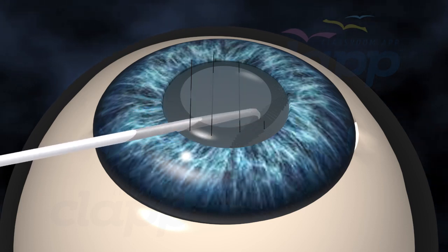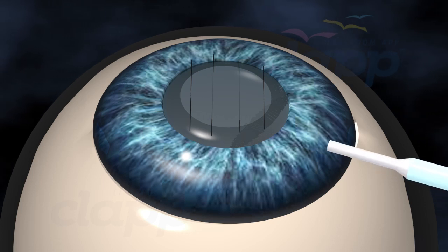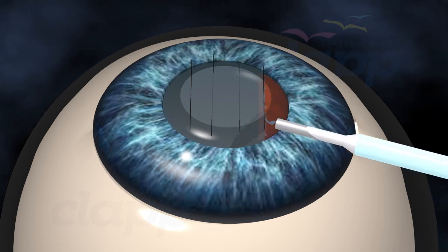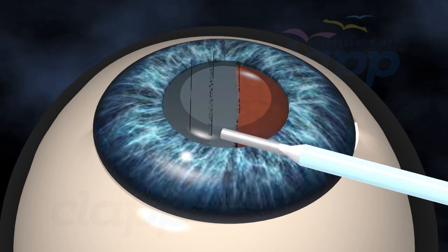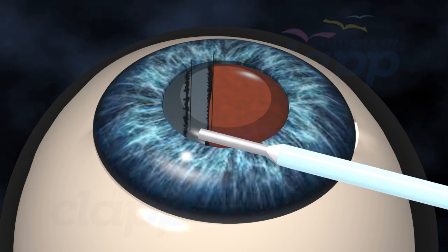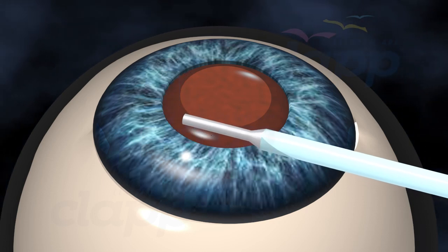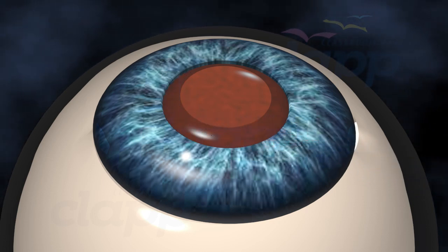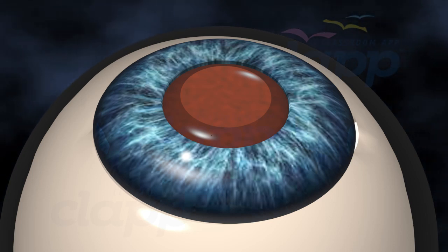Cataract surgery employs advanced techniques such as phacoemulsification. This method uses ultrasonic energy to break up the cloudy lens, making its removal safer and more efficient. The red color can be seen after the cataract lens removal. This orange-reddish color is the reflection from the eye's retina.